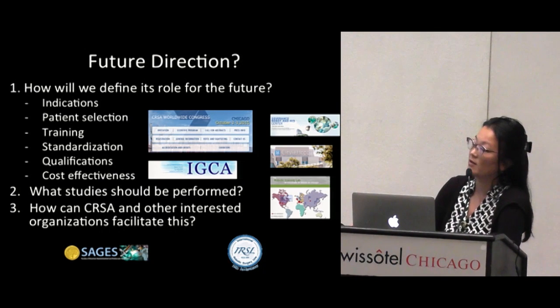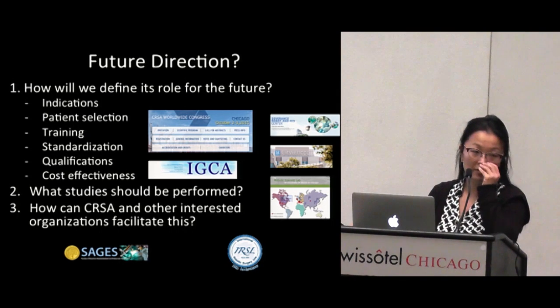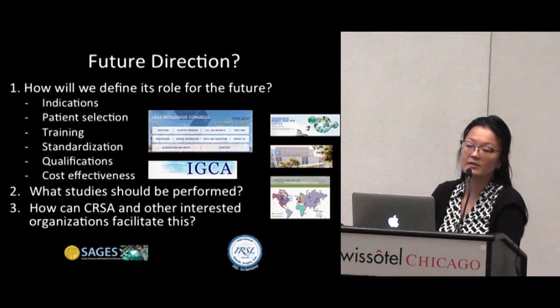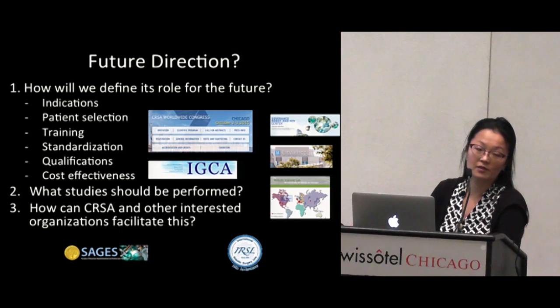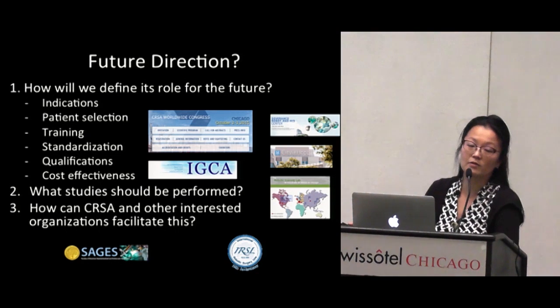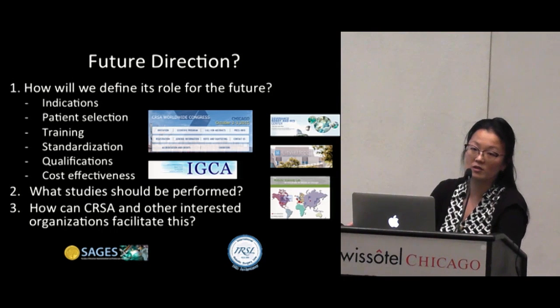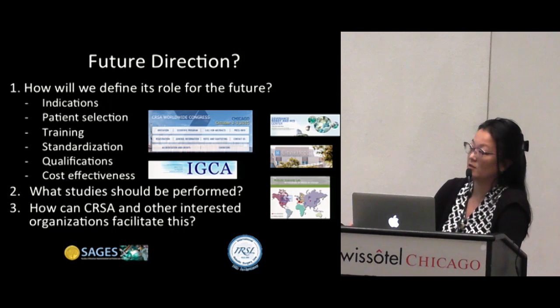And what about the cost effectiveness? Because some studies say, well, the cost effectiveness evaluation really has to incorporate all this insurance issues that we have, and it's very different for all the different countries. For example, in Korea, they have to pay for the robotic approach. For the United States, depends on the insurance and the hospital. The cost does not increase for the patient, so it's a little bit different.